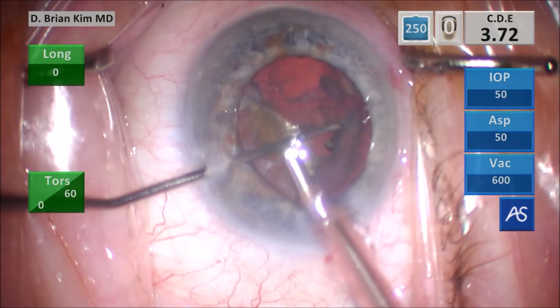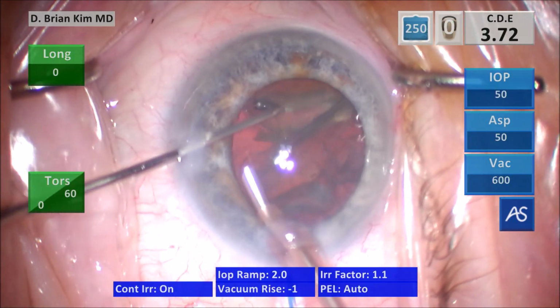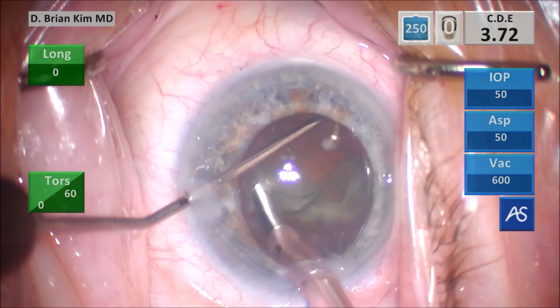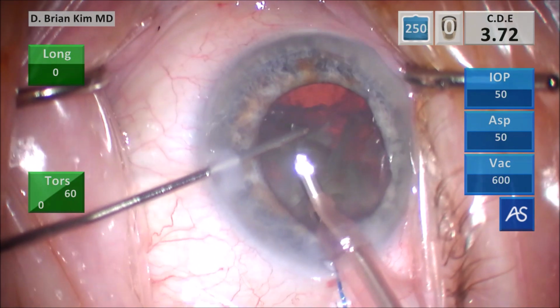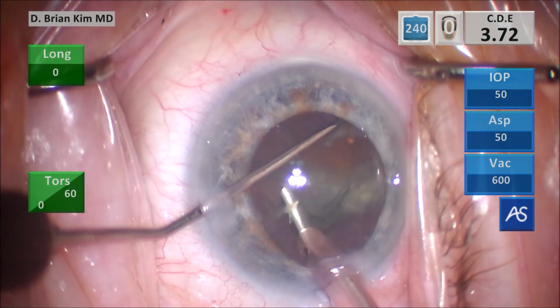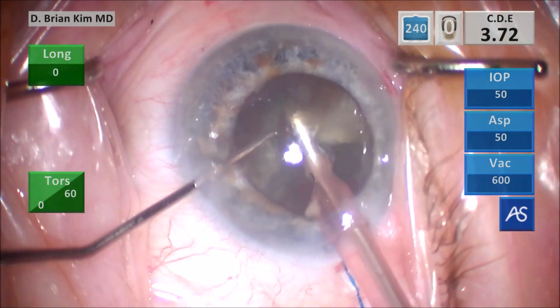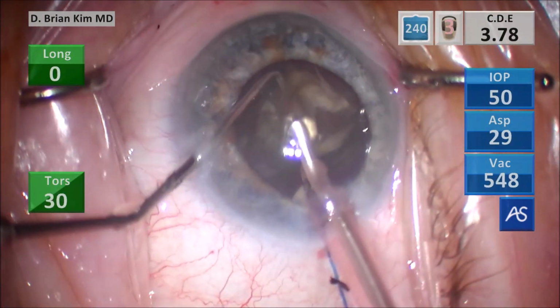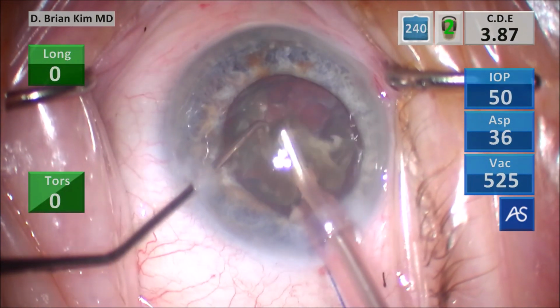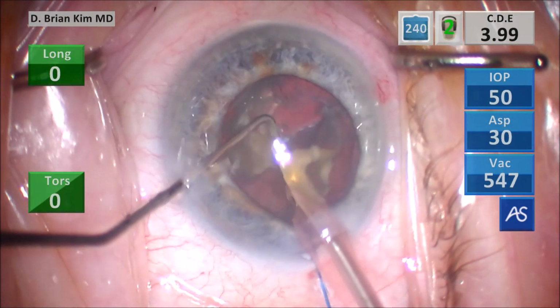So this is the fourth quadrant, the final quadrant, turning it in front of me, placing the chopper around the lens piece, getting around the girth of the lens. Oh, it didn't work. So let's try again. Get around the girth of the lens, placing the fingertip deep, which definitely gets both instruments around the lens, and then I was able to crush it and divide the lens. Getting around that fragment between the two instruments and crushing that piece as well, and then emulsifying the lens pieces.